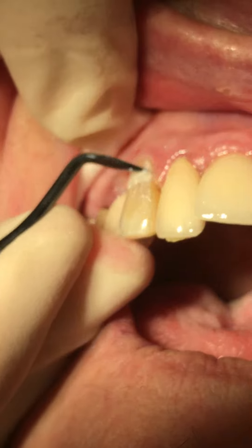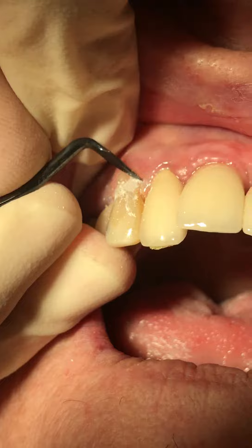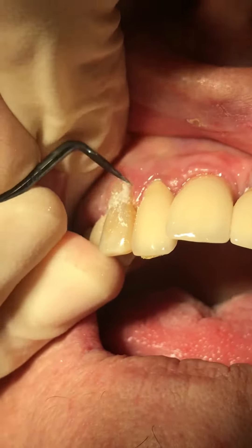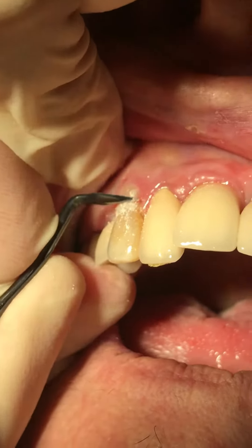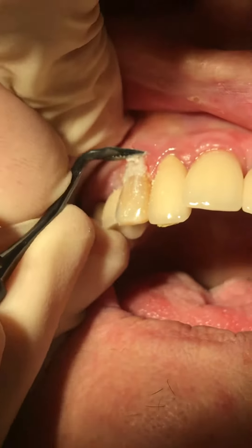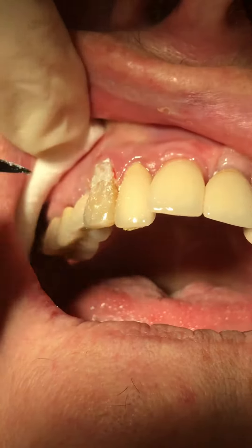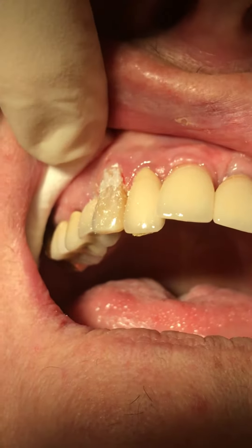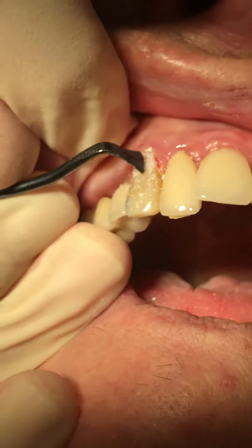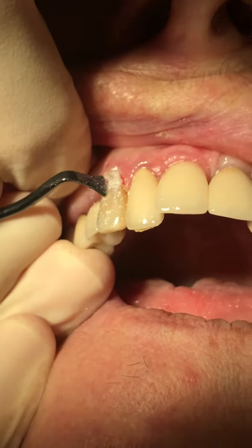If you observe, they are very, very sharp and they feature a very hard surface that can really get the margins trimmed very nicely. In a minute I'm going to demonstrate the other side of the instrument as well — let's go to the other tip so you can really get your margins nicely done.